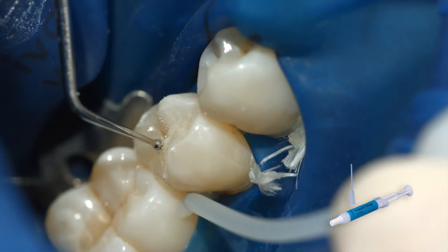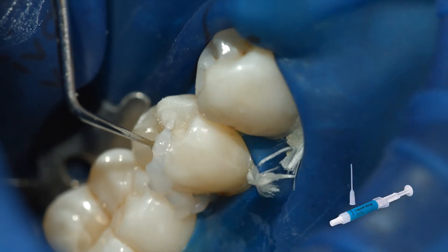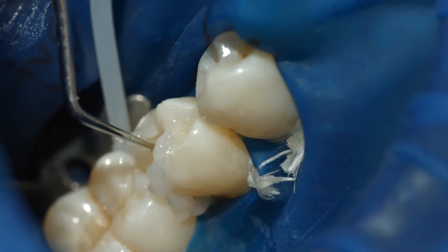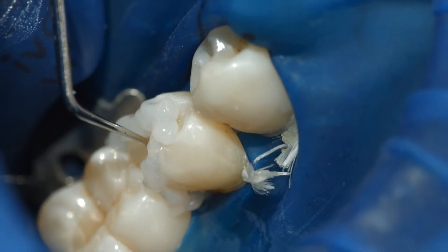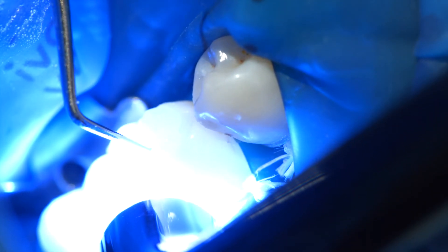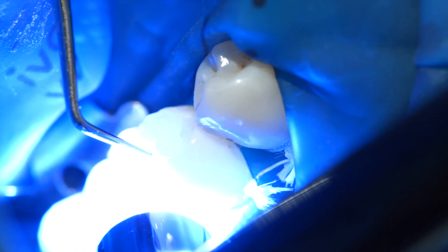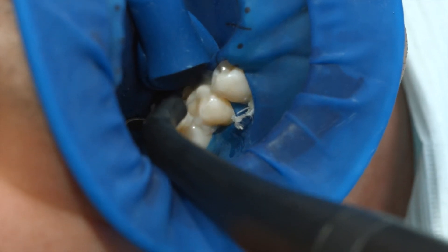Like all other composite resins, Variolink Aesthetic DC is subject to oxygen inhibition. To counteract this effect, cover the restoration margins with glycerin gel or air block immediately after having removed the excess cement. Liquid Strip is an ideal product for this purpose. Light cure all cement lines again for 10 seconds per segment and per millimeter ceramic, using for example blue phase style at a light intensity of 1100 mW per square centimeter. Rinse off Liquid Strip.